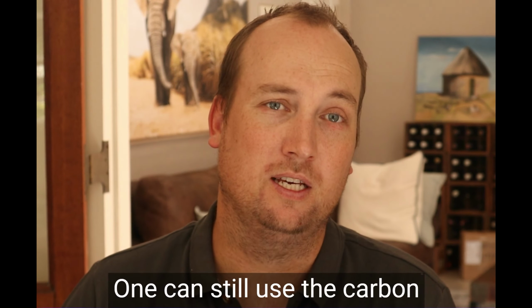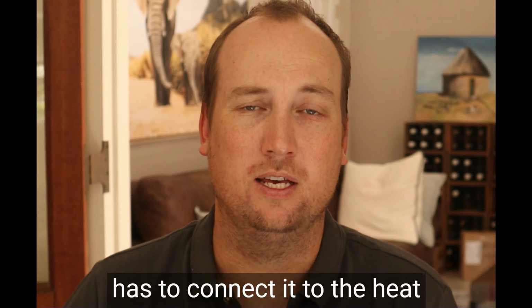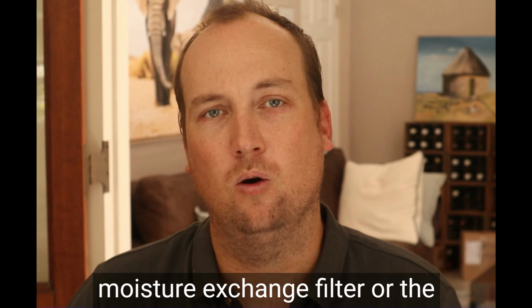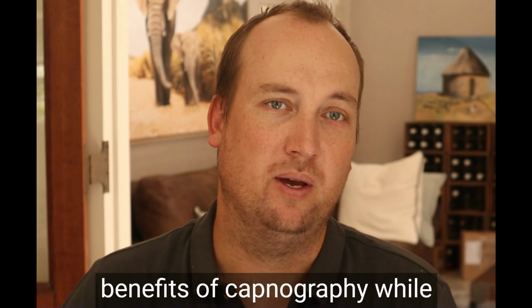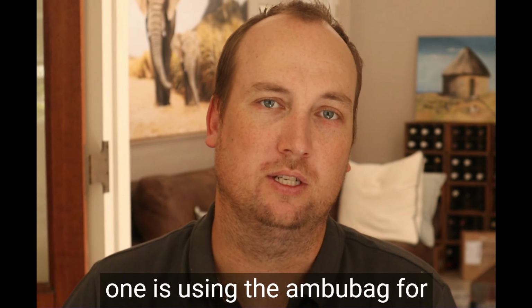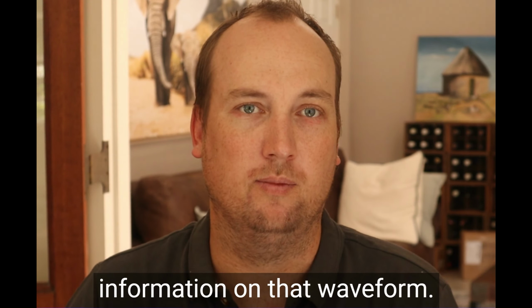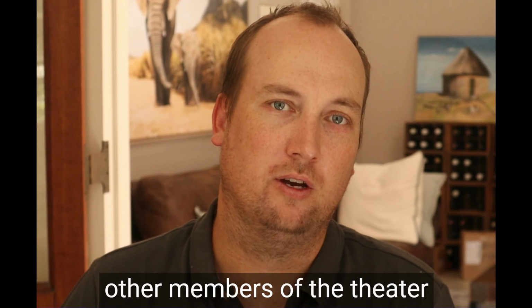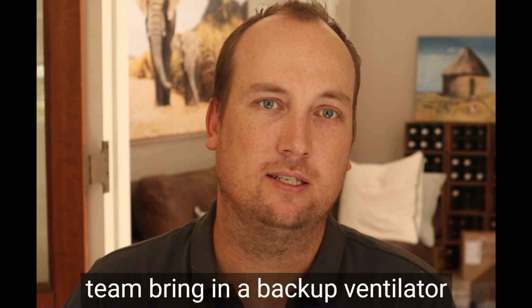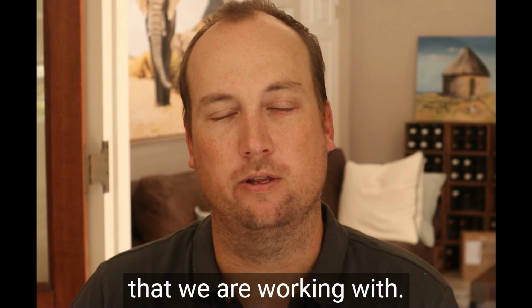One can still use the carbon dioxide gas sampling line in these conditions. One just has to connect it to the heat moisture exchange filter or the elbow piece on the breathing circuit, so that one still has the benefits of capnography while one is using the AmbuBag for ventilation. And then one has the benefits of this feedback and this information on that waveform. My focus has now shifted towards patient safety, while other members of the theatre team bring in a backup ventilator or try to correct the leak on the anesthetic workstation that we're working with.